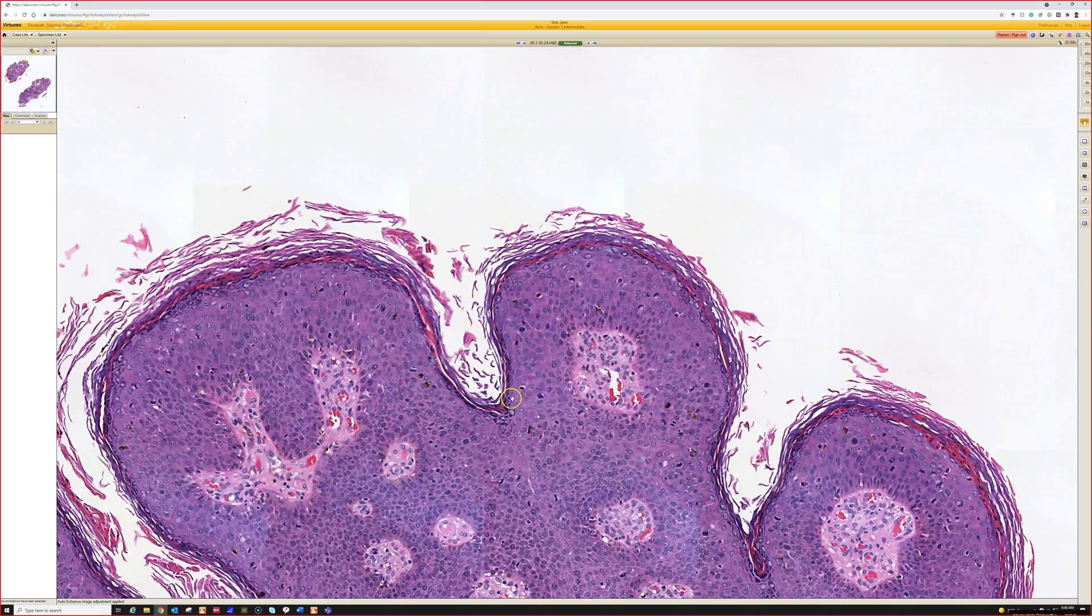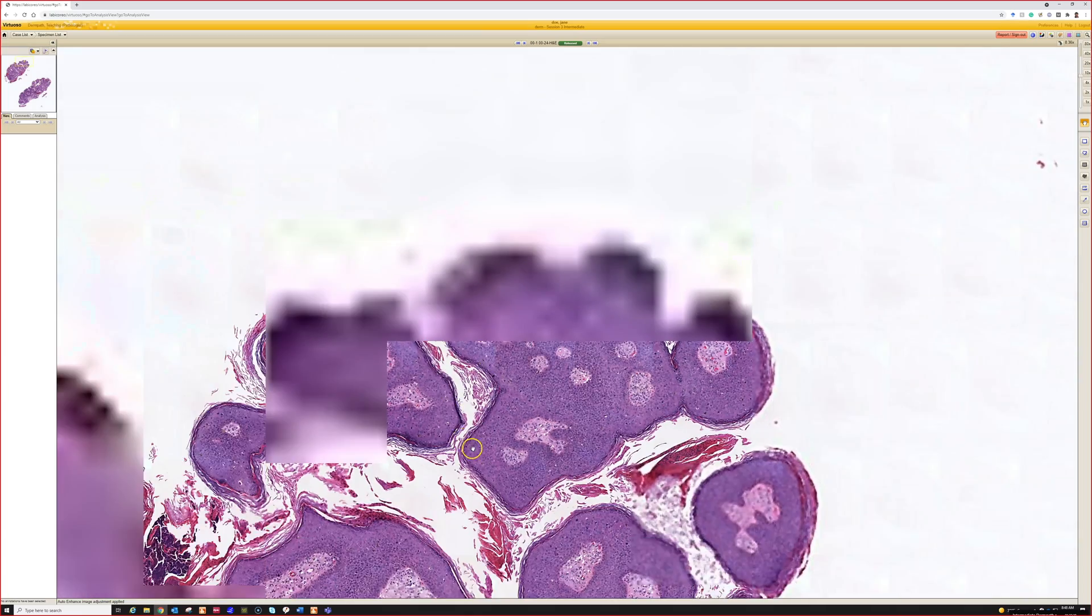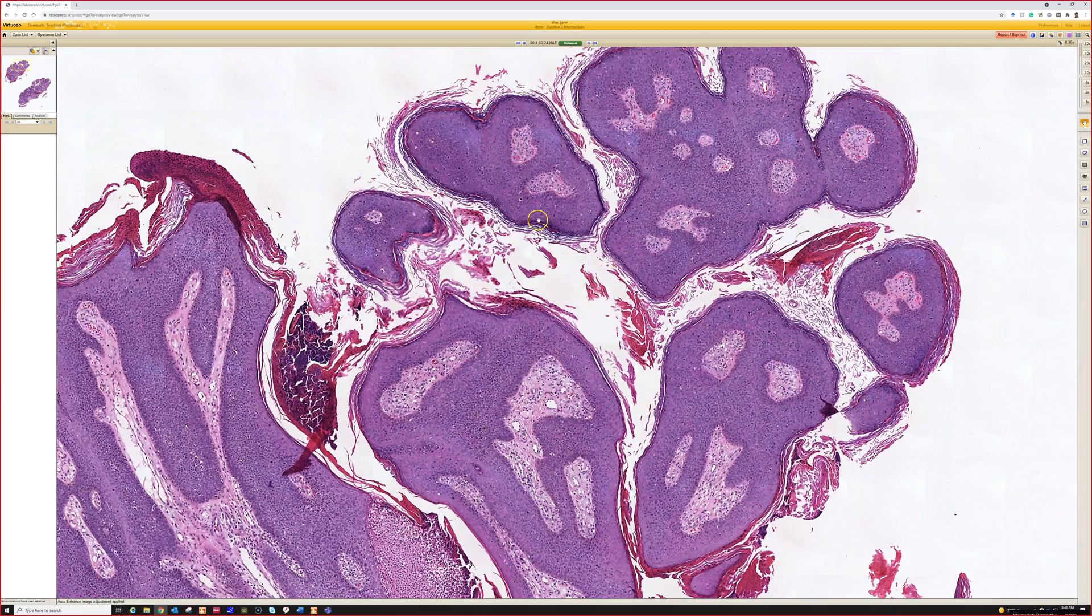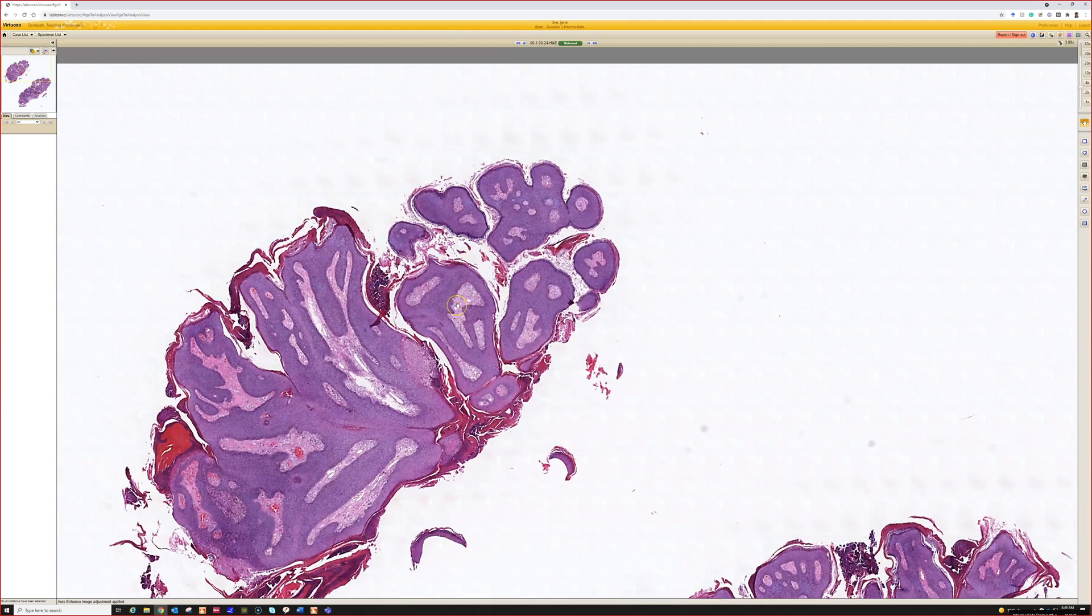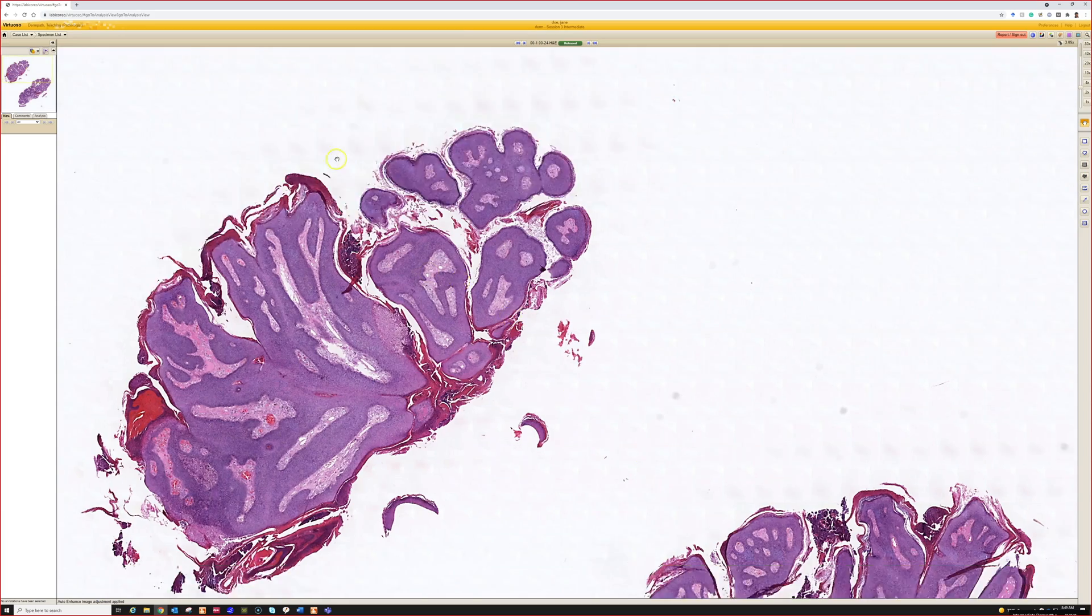In any case, it's high grade dysplasia driven by high-risk HPV. So if I saw this I would actually call it condyloma, probably because of its polypoid shape. I'd say this is condyloma with H-SIL, high grade squamous intraepithelial lesion.